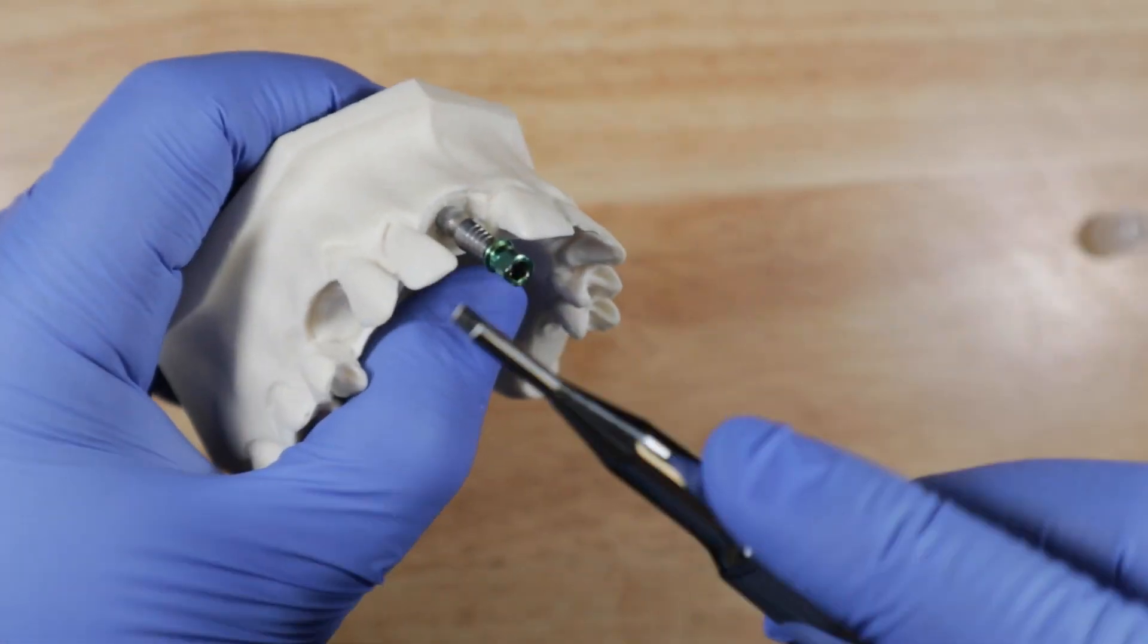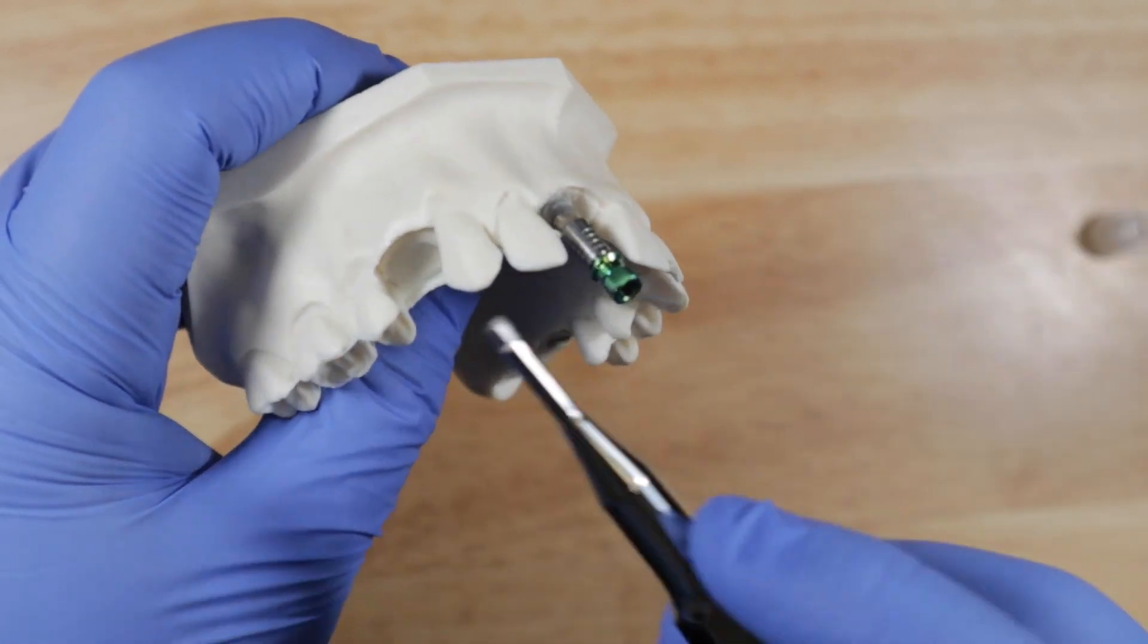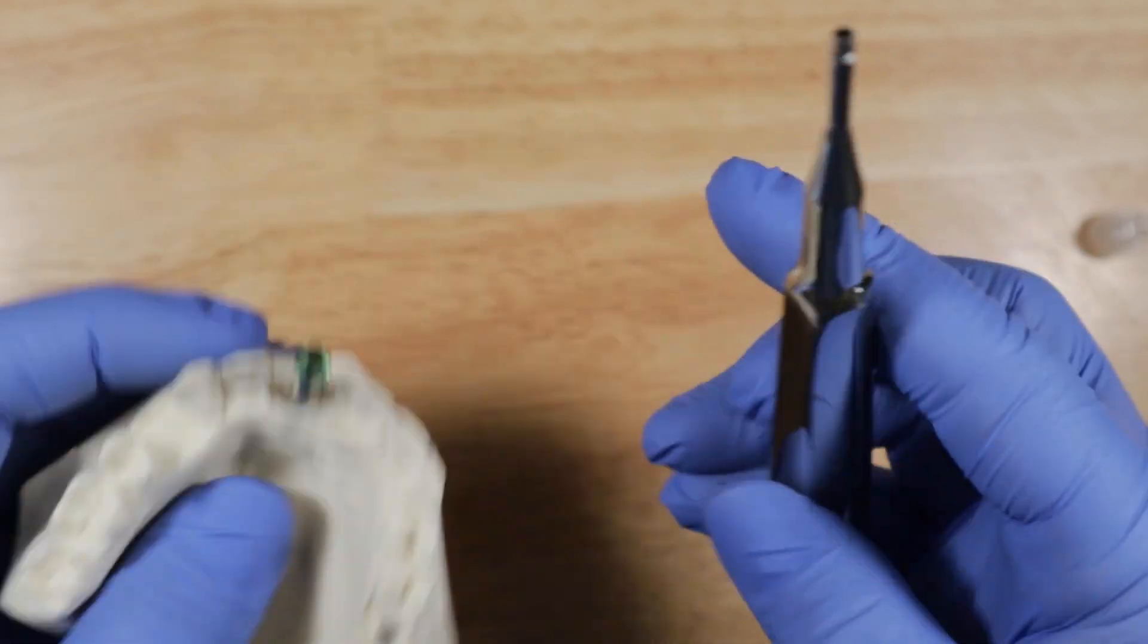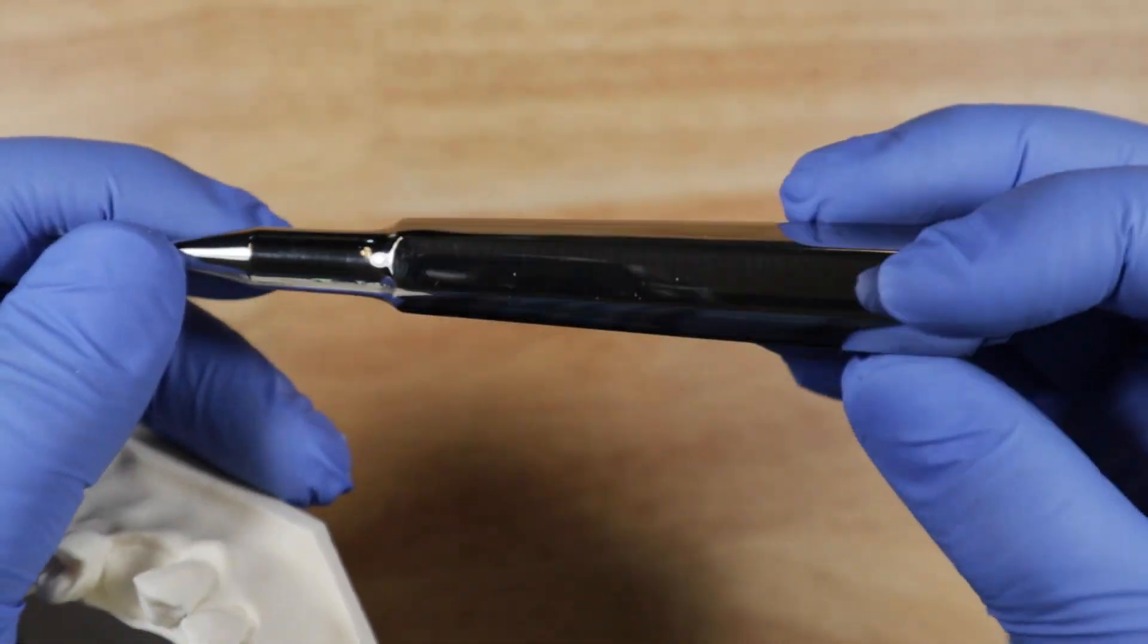So that way it goes in in a very controlled manner and it's very helpful for basically anywhere from premolar to premolar for the maxillary arch. I really love this little tool, super helpful.